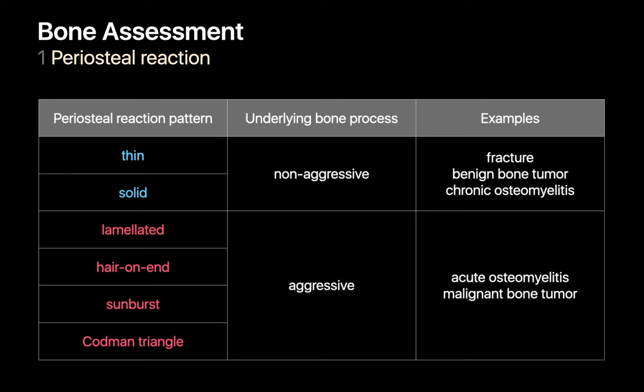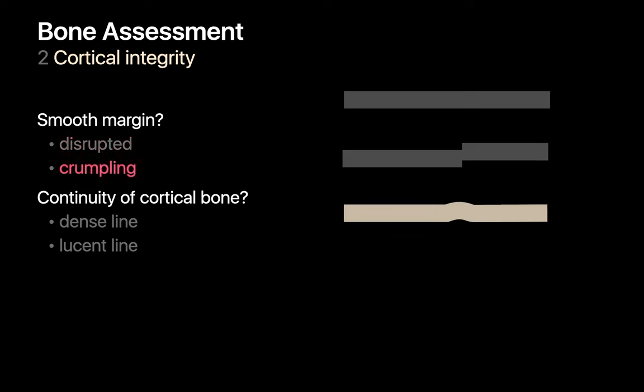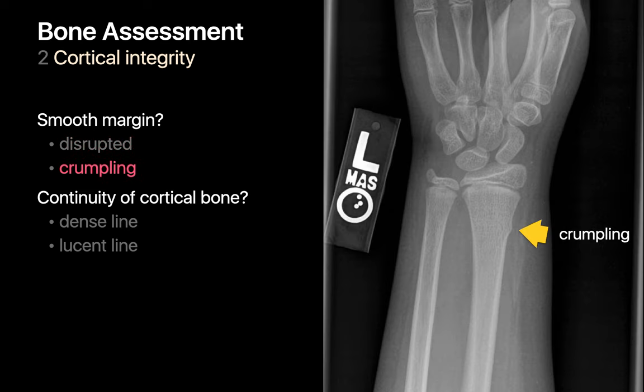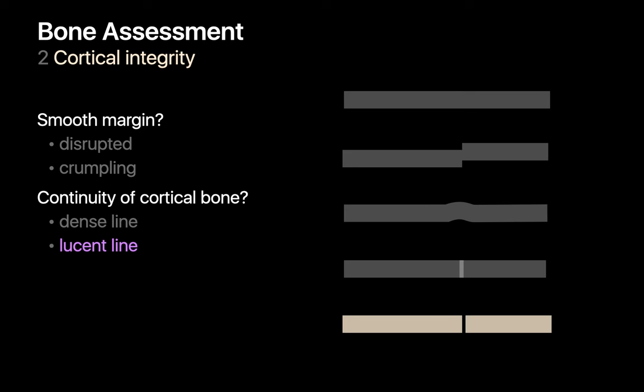After you check for periosteal reaction, check the integrity of the cortical bone for any evidence of fracture. Are the cortical margins entirely smooth and uninterrupted? Or do you see focal disruption or crumpling of the cortical margin, like in this child's distal radius? Or has a fracture resulted in a cortical bone discontinuity that looks like a dense line on x-ray because the cortical bone on both sides of the fracture plane slightly overlap? Or is there a lucent line because cortical bone on both sides of the fracture plane are now slightly distracted from each other?